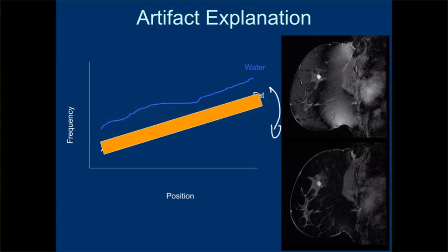Now the main issue with the breast is, this is the Z direction, right? This is Z usually. And you have an object which has a kind of abruptness in the Z direction. That causes huge susceptibility artifacts, because of the air and tissue interface. So that curve over here is a killer. The shoulder, by the way, I think that's what Shreyas showed in his talk, but the shoulder is the same thing, an air tissue interface in the Z direction. That's a big deal.